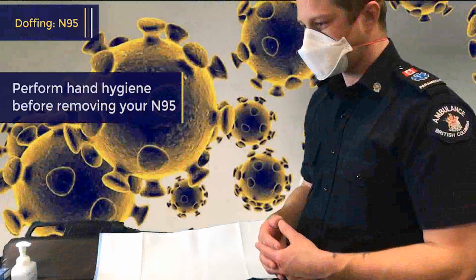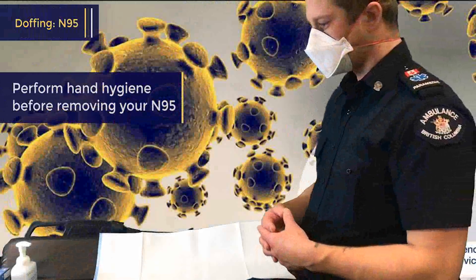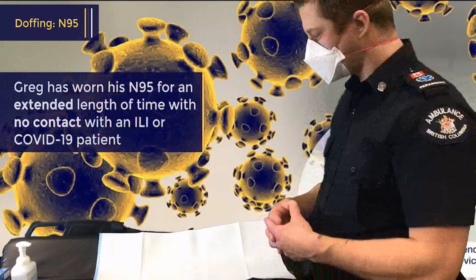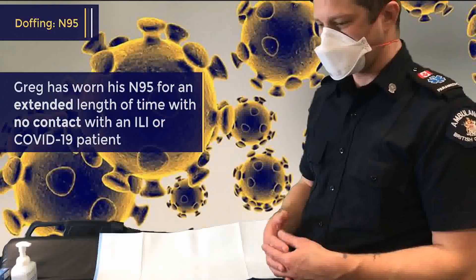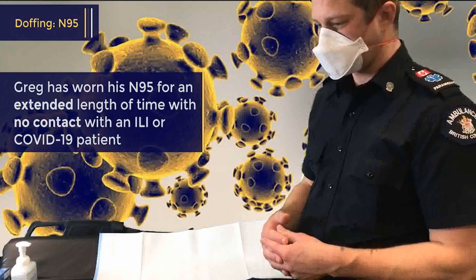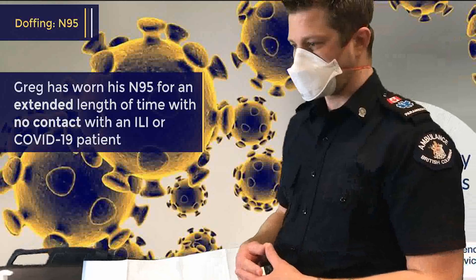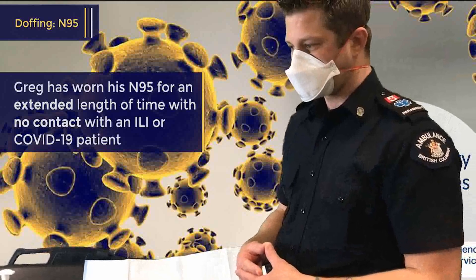It's always important that we clean our hands before we touch our face. As you can tell, Greg has been wearing his N95 for an extended period of time, as recommended in COVID-19. Now Greg wants to go for his cup of coffee, so we're going to take off his N95 safely and store it for later use.